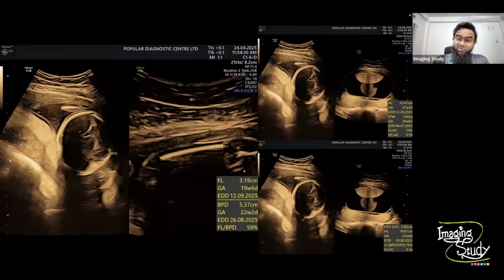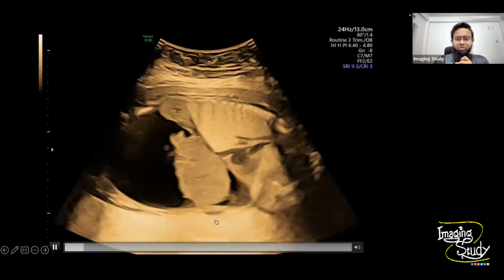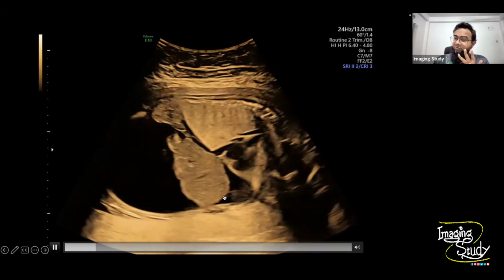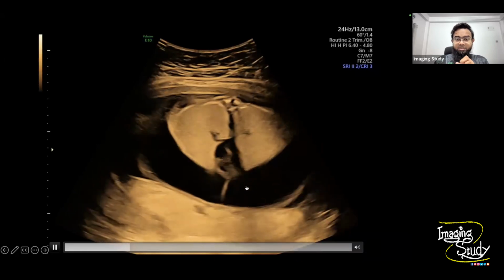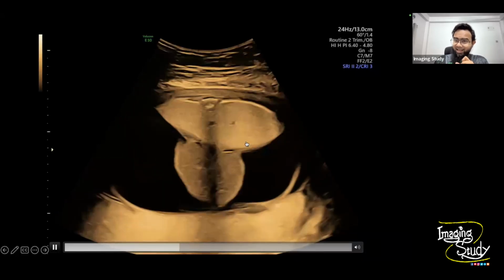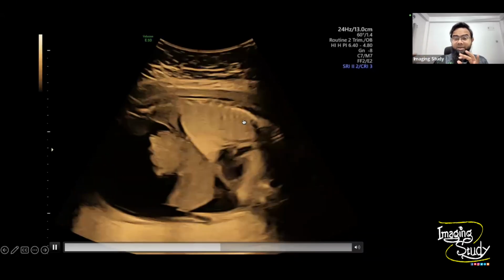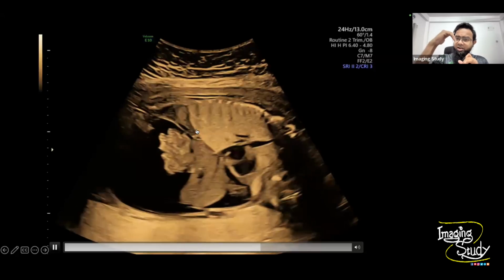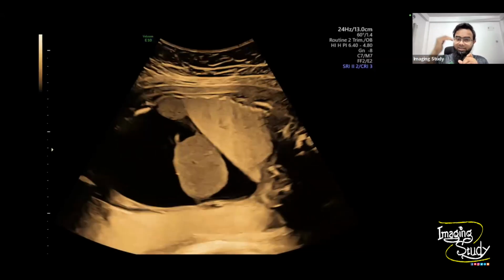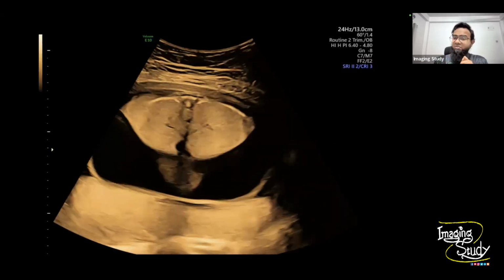But there's something else also. Let's see what we have got on this ultrasound. Here you can see the lung section. We have multiple findings. What you are looking at is ascites. This is not pleural effusion. This is ascites. The problem is in the lung. You see these are the lungs. These are very big lungs. And this one is the diaphragm. The diaphragm should have its convexity upwards, but here you can see it has convexity downwards, which is called an everted diaphragm.